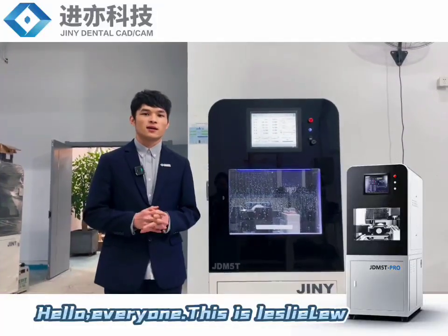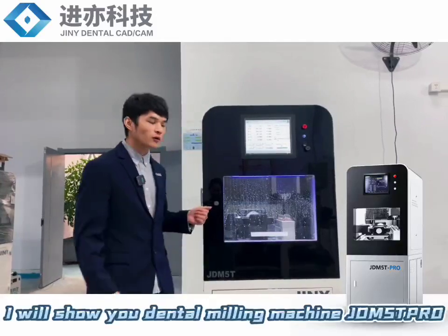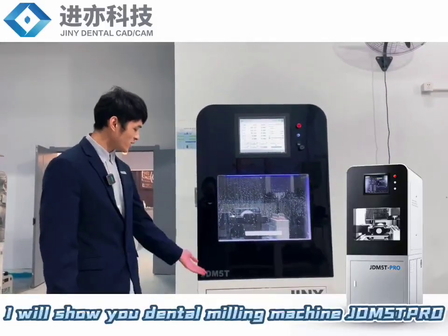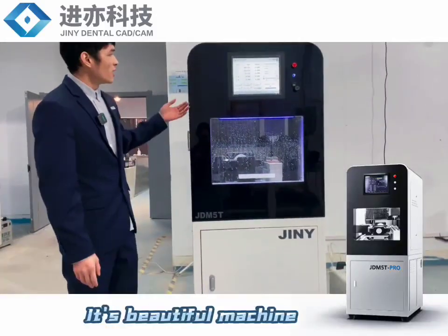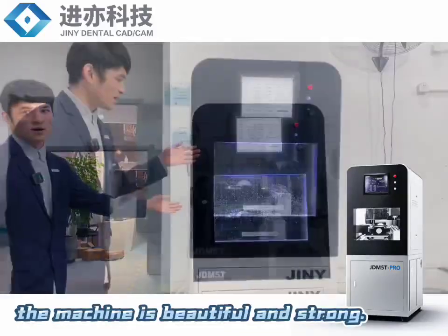Hello everyone. This is Leslie. I'm from Shanghai JINY Group. I will show you our dental milling machine. It's a beautiful machine that you can see. The machine is very beautiful and strong.